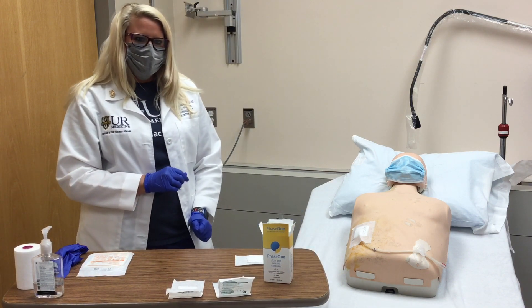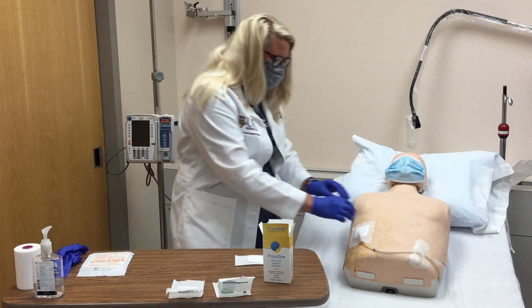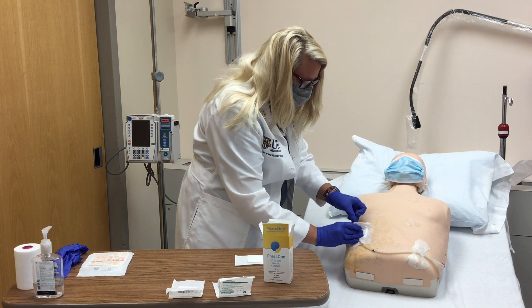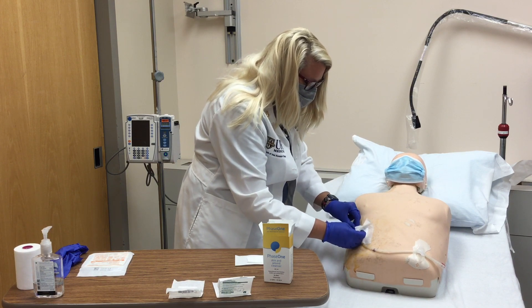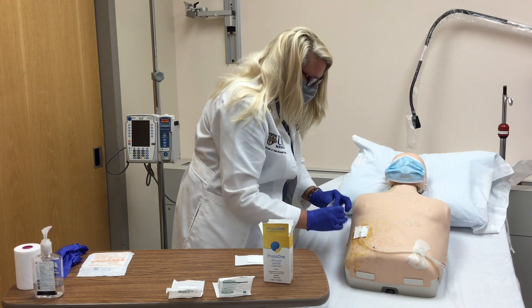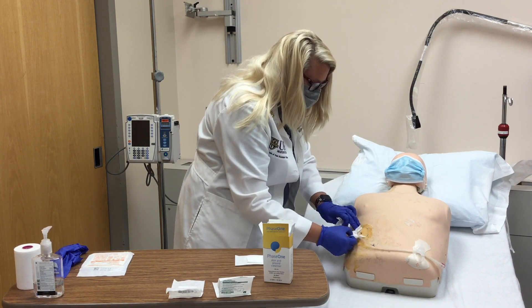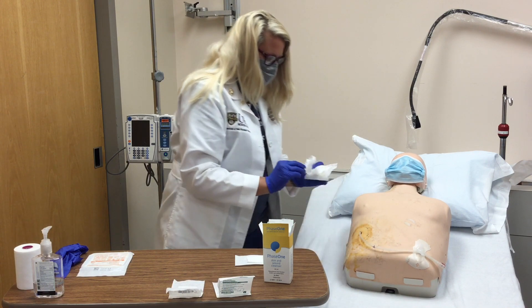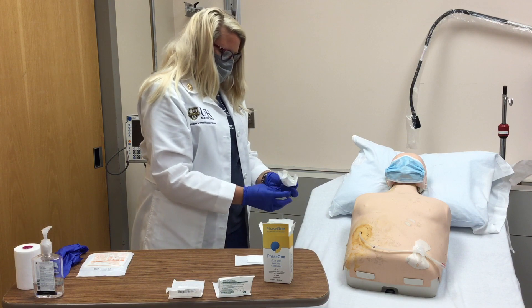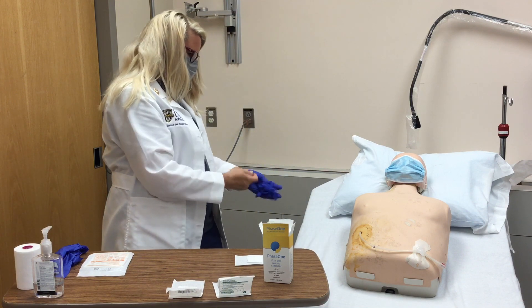With your non-sterile gloves on, loosen and remove the old dressing. Inspect the exit site for signs of infection. Discard your gloves and old dressing.